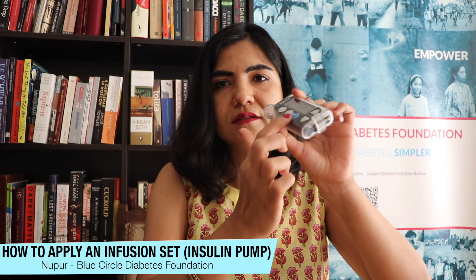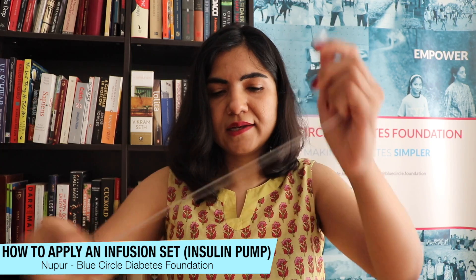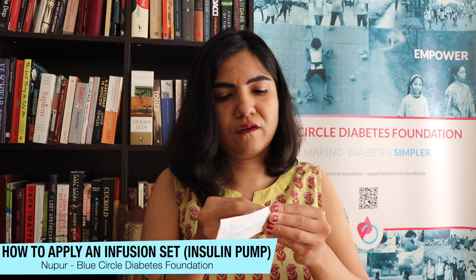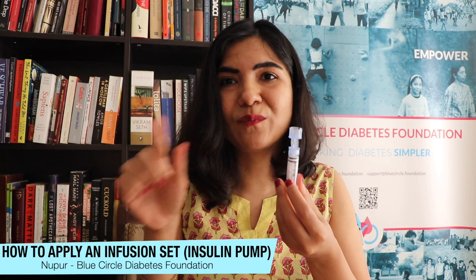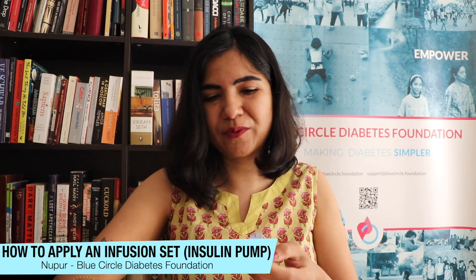That rewinds the pump. What you need to do after that is take a new reservoir from a new packet, open it up, and fill it with insulin — this is then what goes into your pump and you're ready to go.